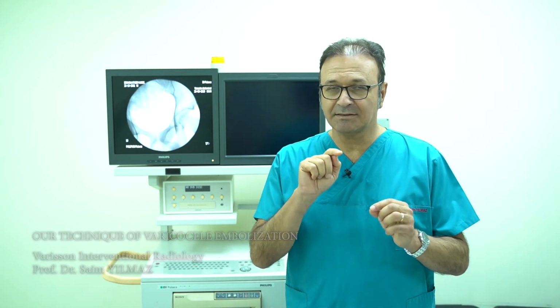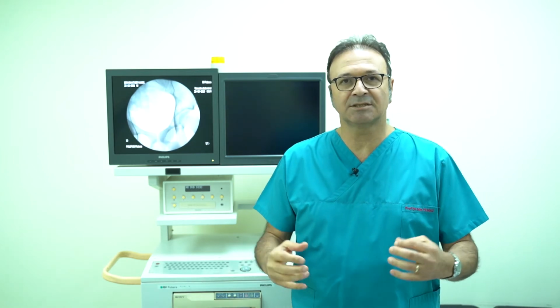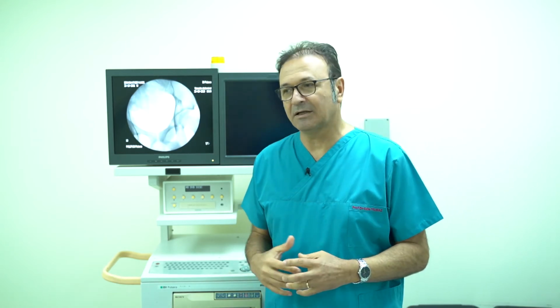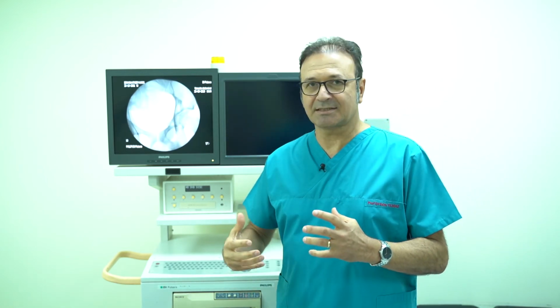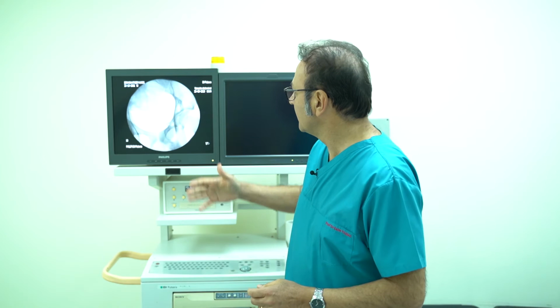After we enter the left renal vein with a diagnostic catheter, we ask the patient to strain. When he strains, the intra-abdominal pressure increases, and so the reflux or backflow begins. We can see this reflux on the angiography screen like this.